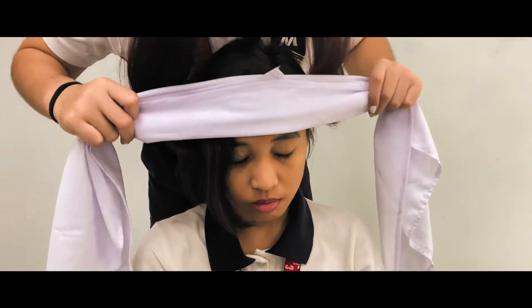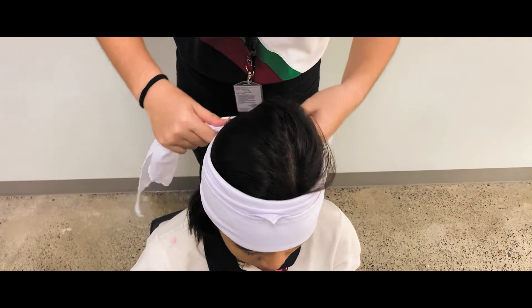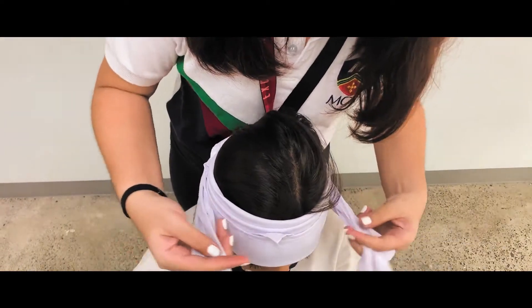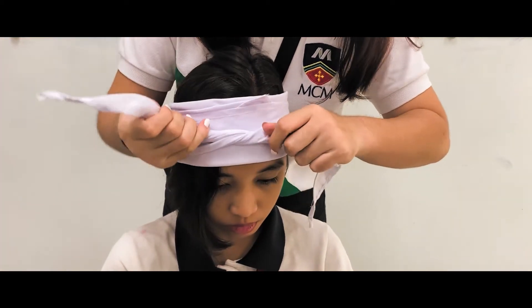Next up is the forehead bandaging. Create a narrow cravat and begin by placing the bandage on the forehead. Take both legs of the bandage and tie it around the patient's head. Create a square knot on the forehead area to wrap things up.